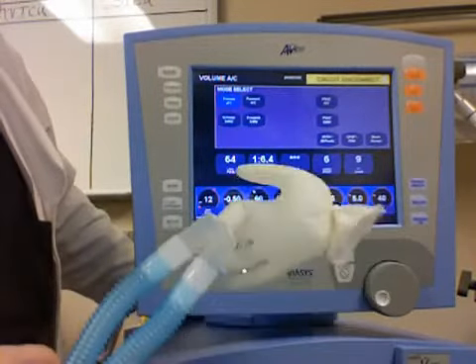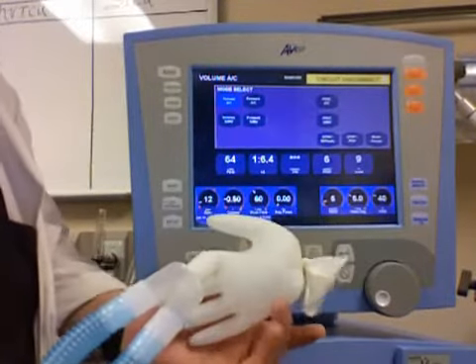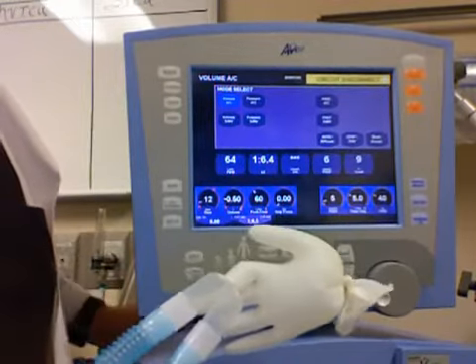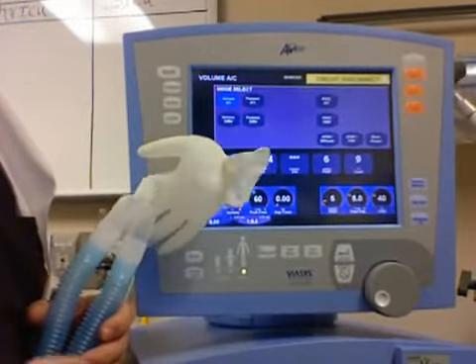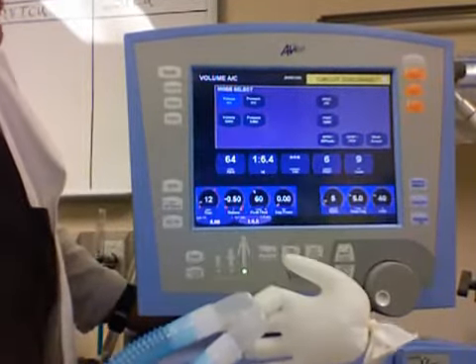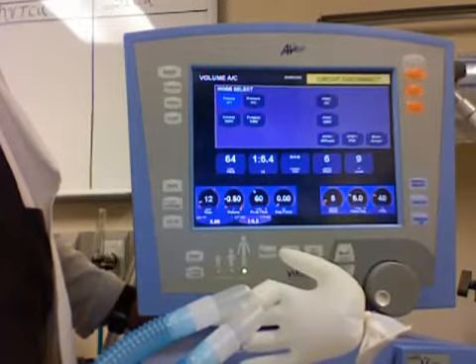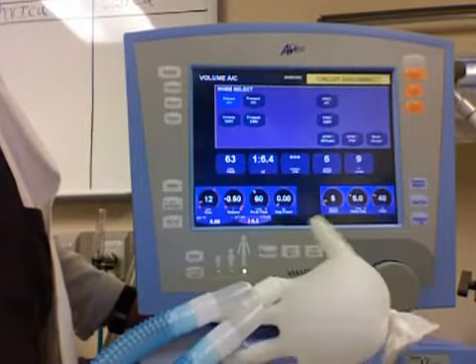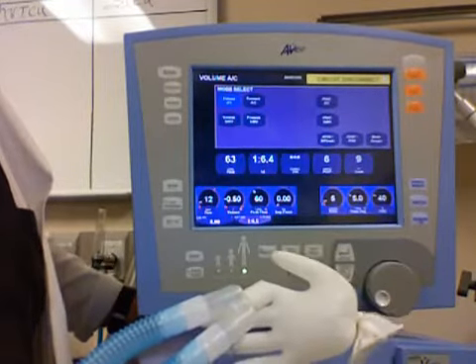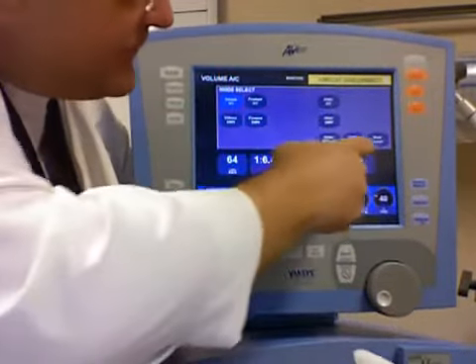And right now this ventilator is set on 500 so that the breath is over when the 500 has been delivered to this system. And then it lets it escape. Now, there's an exhalation valve inside the machine here that holds the breath until the tidal volume's been delivered. It's kind of like what you see on your IPPB. It holds so that the pressure can build in the circuit while the 500 is being delivered, and then after the 500, your cycling criteria turns it off. So I'm going to leave it on volume ventilation right now.